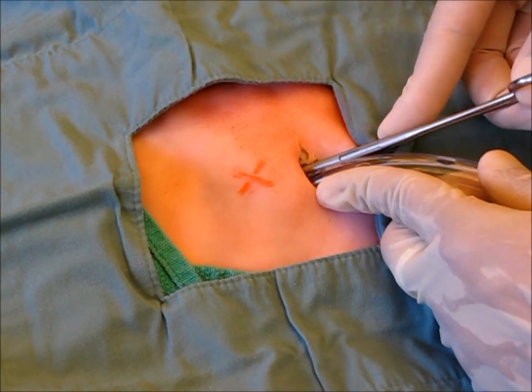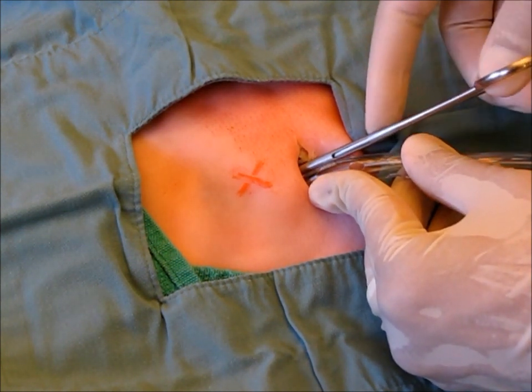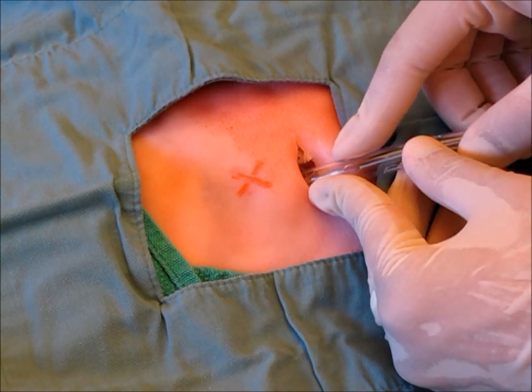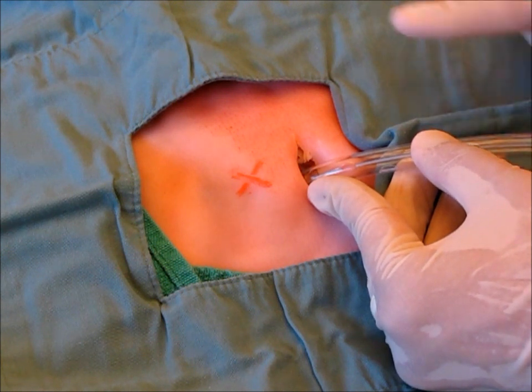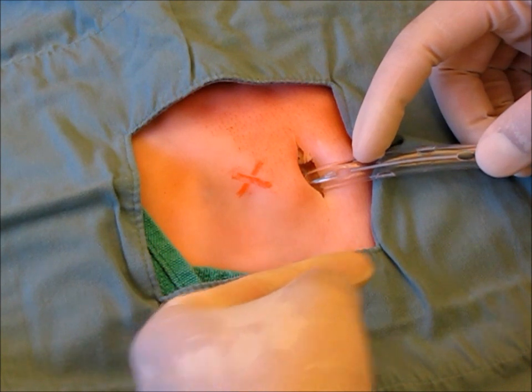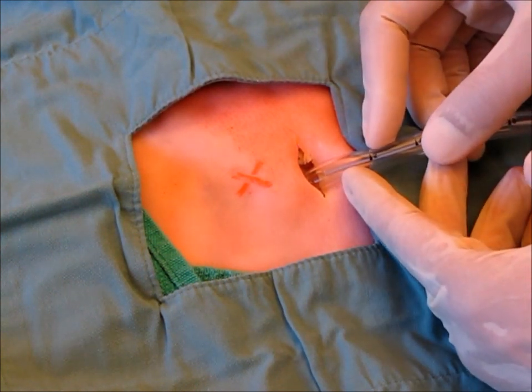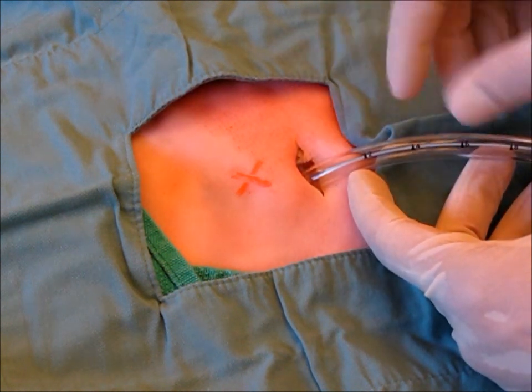Once inside the pleural cavity, secure your chest tube with one hand and remove the kelly. Then, using your dominant hand, gradually advance the chest tube into the pleural space. If you have a pneumothorax, you will be advancing superiorly, whereas if you're attempting to drain a fluid, you will advance it inferiorly. The chest tube should be advanced so that all drainage holes are inside the pleural cavity — approximately two centimeters past the last drainage hole.